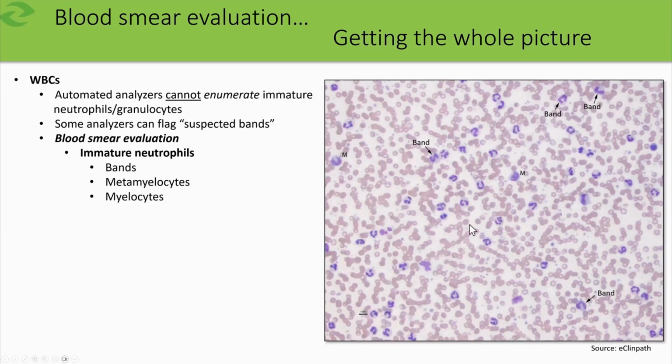This is blood from a dog. There is rouleau present and potentially some agglutination, kind of forming that little grape-like cluster there. So if we weren't sure, we could do that saline dispersion test. Automated analyzer results should tell us that there's a leukocytosis, but as we can see here, and this is at a 50x magnification, that leukocyte density is increased, red blood cell density decreased there. The primary cell type are segmented neutrophils, but there are band neutrophils present. Band up here, band there, band down here.